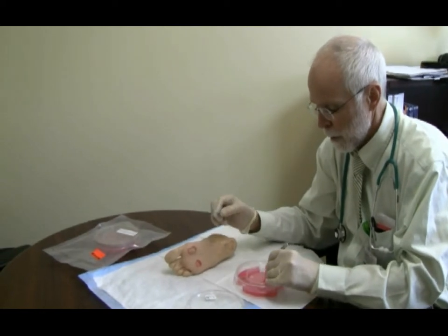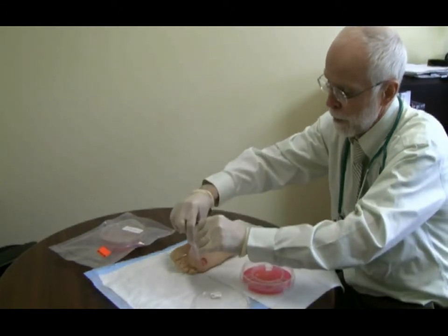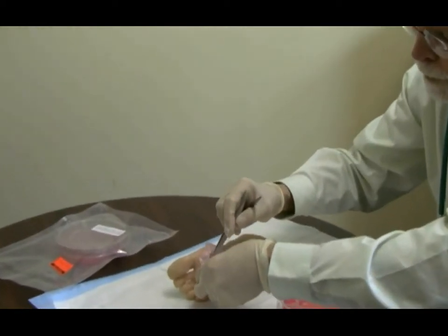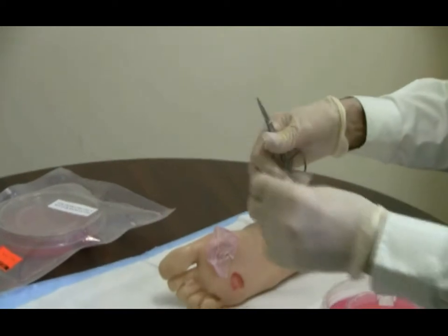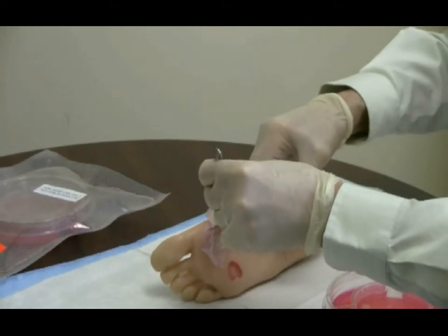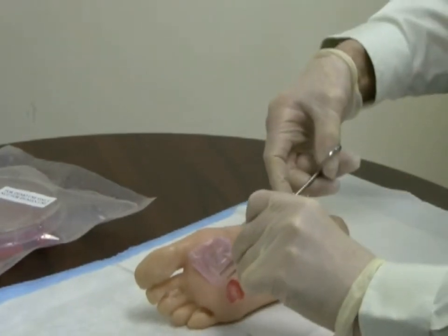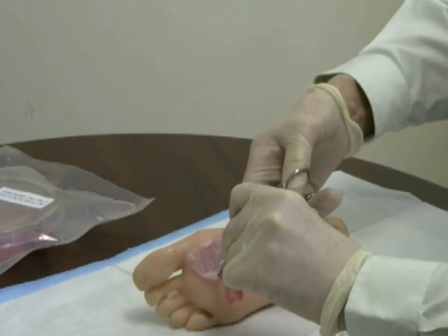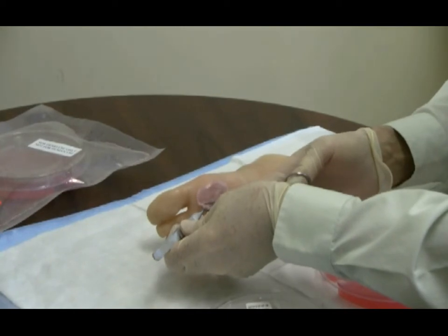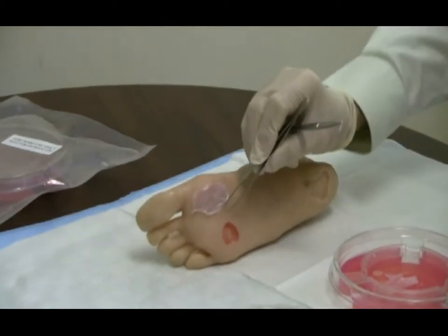This is a small bit of living skin that's been cultured on this agar plate. It's put right on this area, right over the ulcer. Trimmed appropriately. We would put Steri-Strips and a dressing over this area.